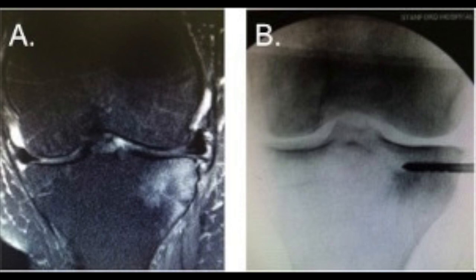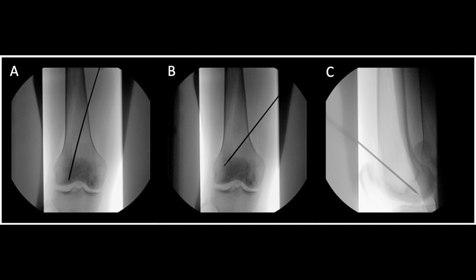Image A shows a bone marrow lesion on MRI at the lateral left tibial plateau. Image B shows core decompression of the bone marrow lesion through the nearest cortex on fluoroscopy with the patient laying supine. On the other hand, this image demonstrates the biologic route.